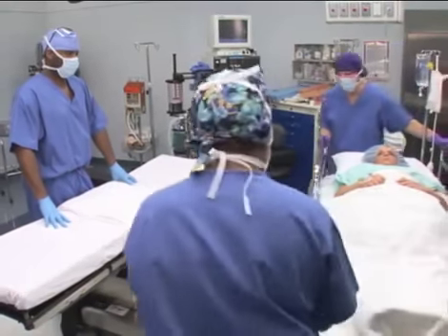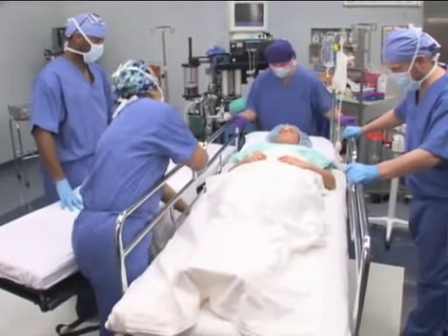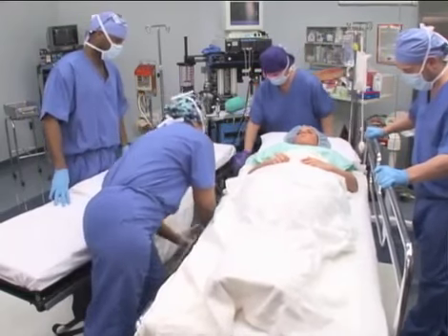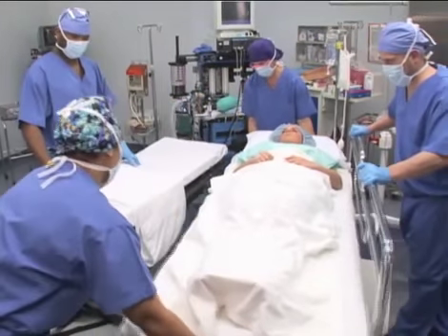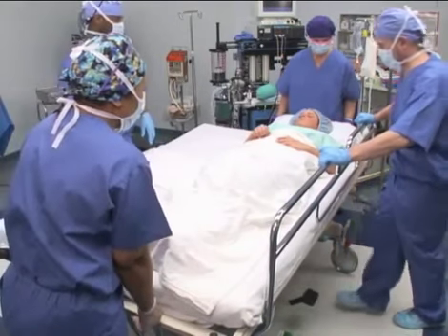Patients may be unsteady or semi-conscious, unable to use protective mechanisms that would normally prevent falls or other injuries. Diagnostic and operating room tables are narrow. Transfer vehicles, such as stretchers, if they are not locked, can slip unexpectedly. It is the surgical team's responsibility to perform safe transfer, protecting the patient against injury during surgery.